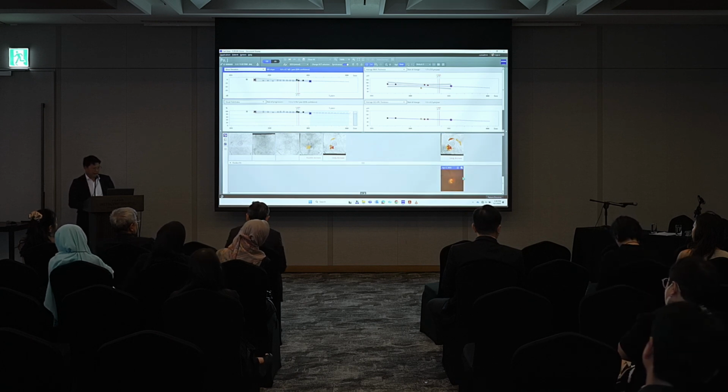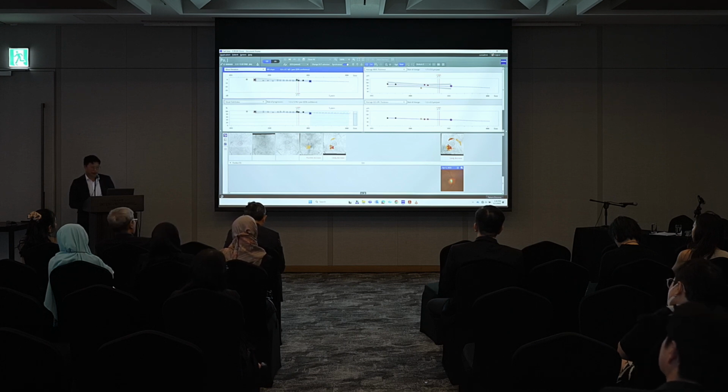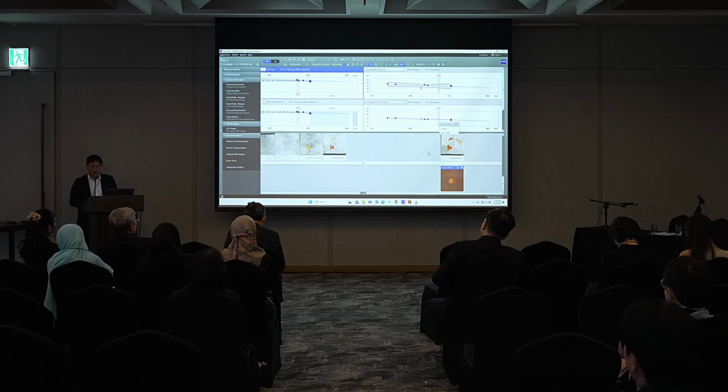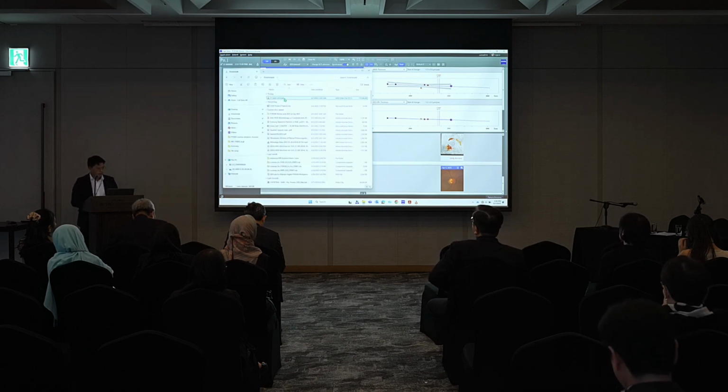And what's nice about this is that if you've got a Claris, it will also integrate the Claris fundus photo with an automatic segmentation. Just to break it up. So at this point, I'm going, hey, your glaucoma's worse. And so here's the patient's surgery. They've got a failed PreserFlow microshunt.